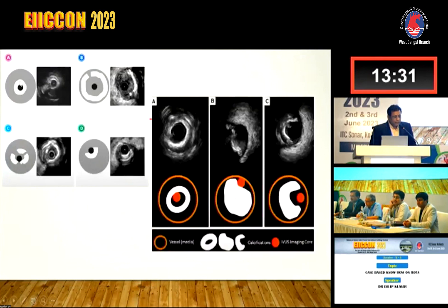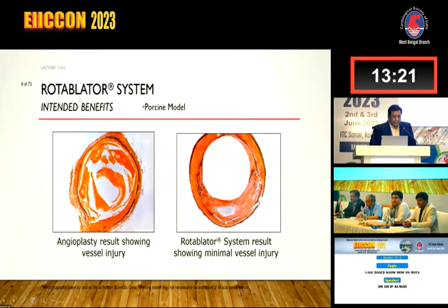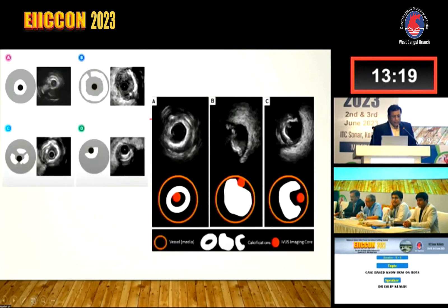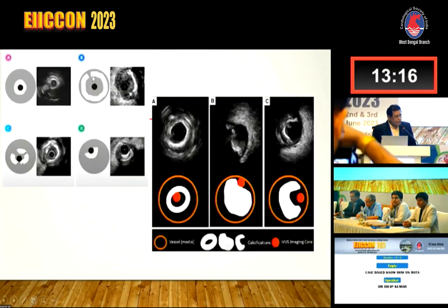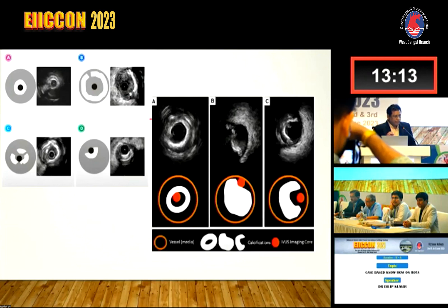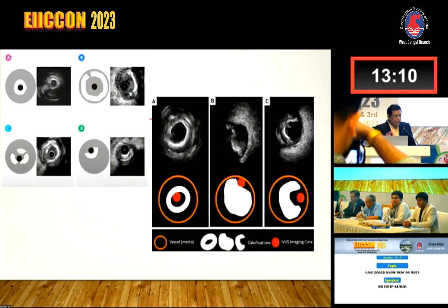This is basically a very superficial and concentric calcium - this is very well treated by rotablation. The second type is deep calcium, although concentric. Rotablation is not going to touch this calcium, so there's no way you can perform rotablation in these cases - IVL is the method of choice.